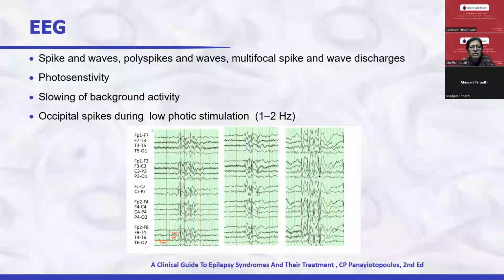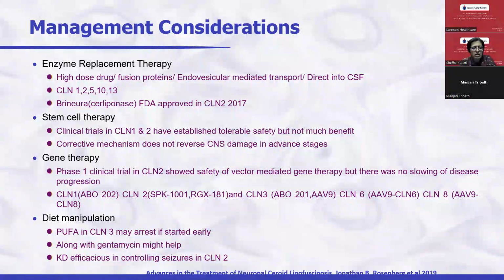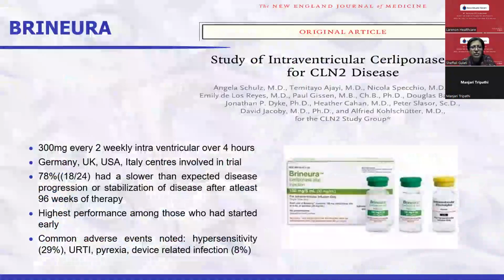So it is important that you have spike waves, polyspike waves, and multifocal spike and wave with photosensitivity, and occipital spikes with low photic stimulation are important to understand. So management, we will not talk about management. Newer things are coming up.